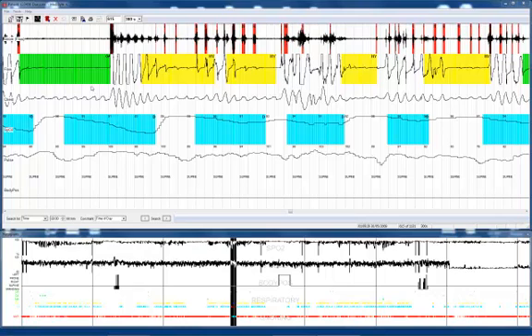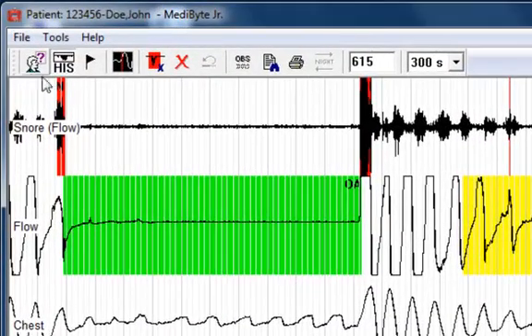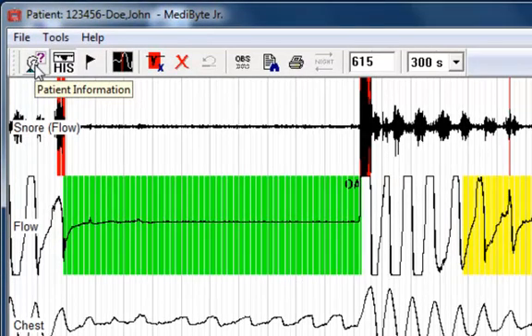Welcome to the Braebon MediByte Junior training video. This video explains the fundamental operations of the Braebon MediByte Junior software. First we're going to discuss the toolbar icons.